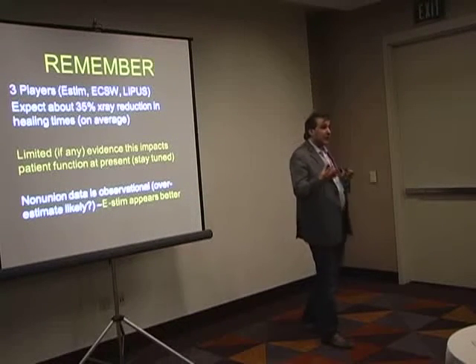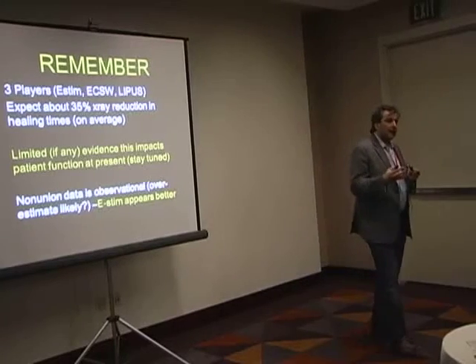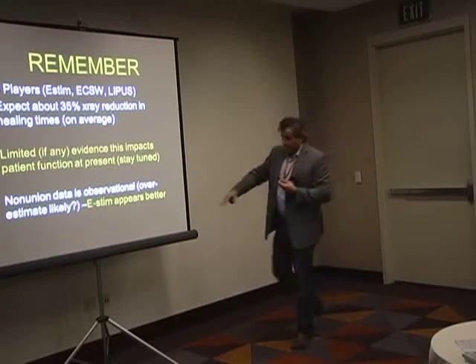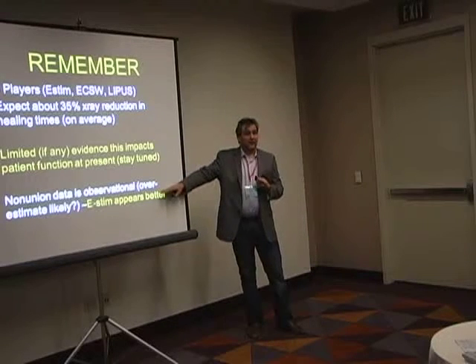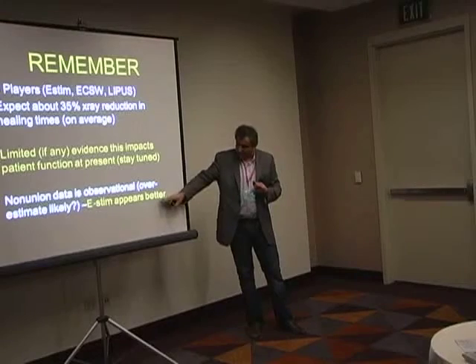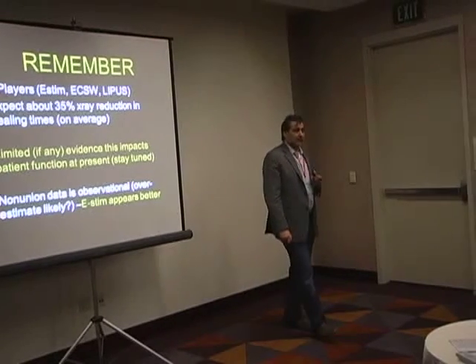So if the numbers you're seeing, you can be pretty reasonable. I mean, if you absolutely believe it works, then you can say it's absolute what it is. But most of us would probably tend to cut that number down a bit from what's reported because of the nature of the study design. But it does appear to favor eStim, and that's kind of where we are today.